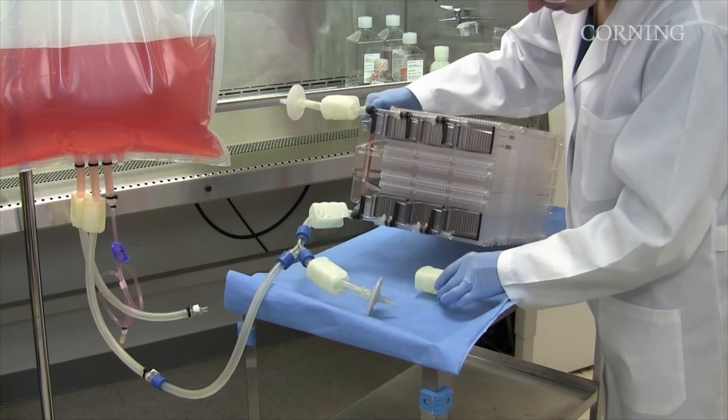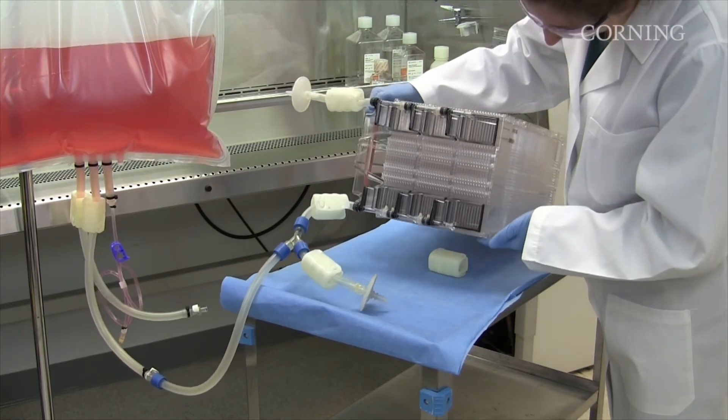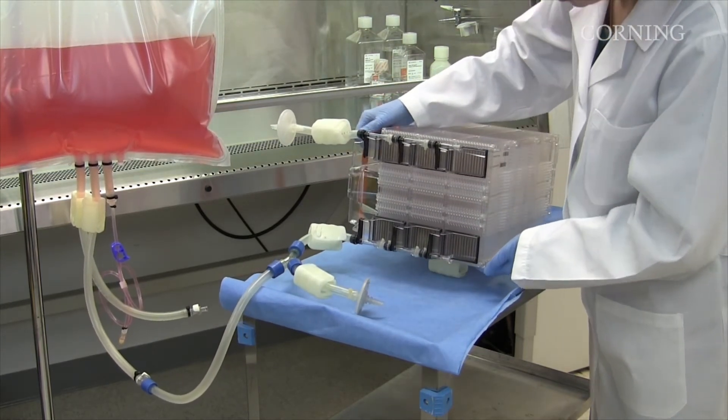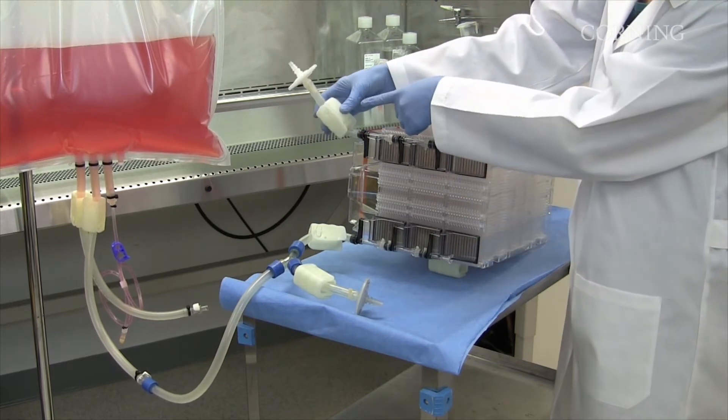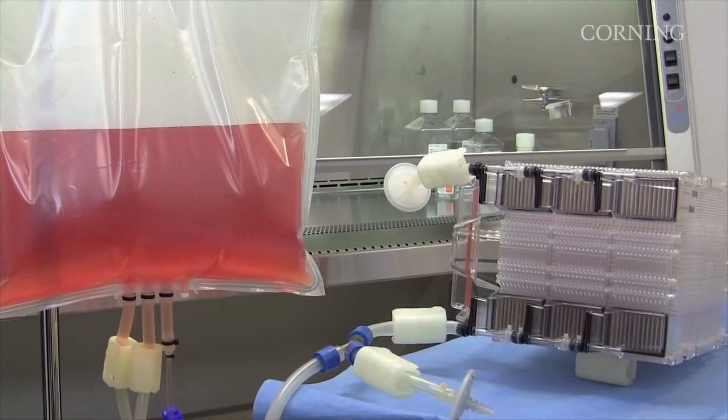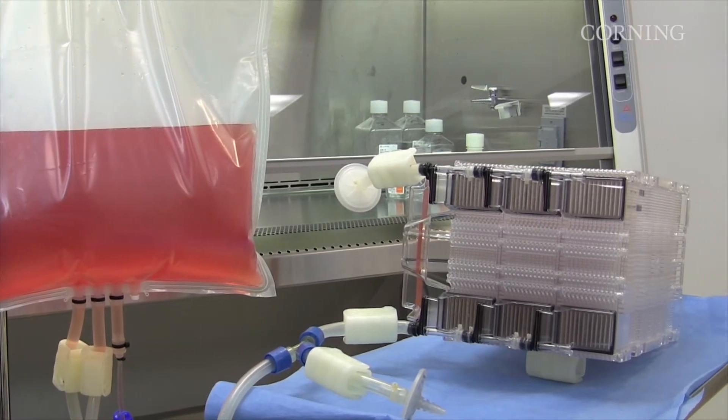Place a clamp or other small object beneath the vessel to raise the front end about 10 degrees. The air manifold should be at the highest point of the vessel. Position the source vessel at the same level as the HyperStack vessel.